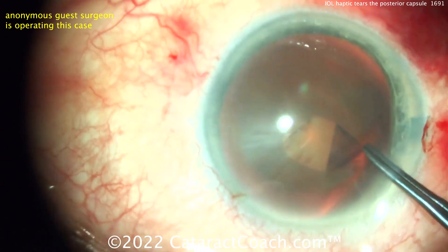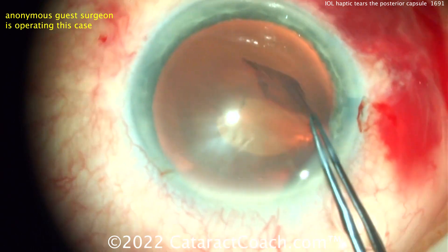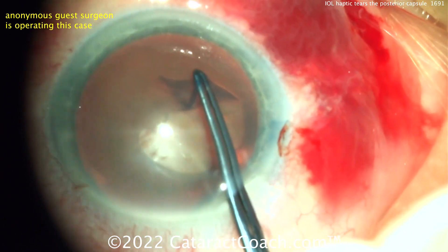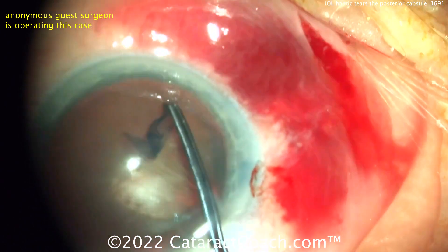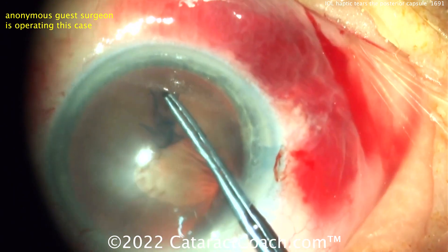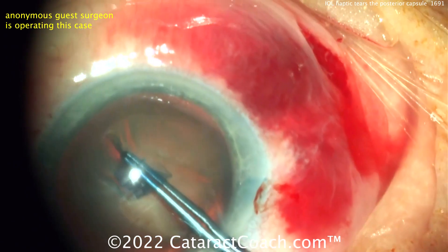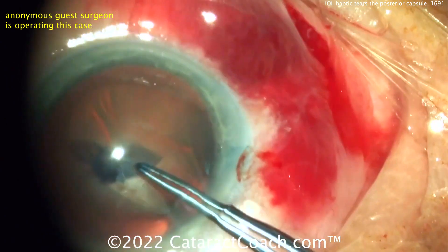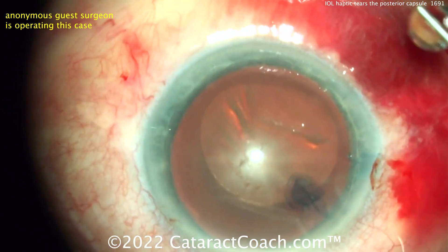We'll cut ahead right to the end of the case. The rhexis looks pretty good — trypan blue has been used to stain the capsule. It looks like a reasonable rhexis coming around, a little close to the periphery for my taste, probably a little too big. Now completing that capsule — going too small on the rhexis. This is something you definitely want to practice; you want to be able to get a really nice capsule rhexis.